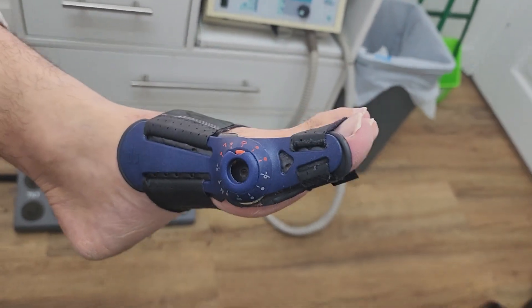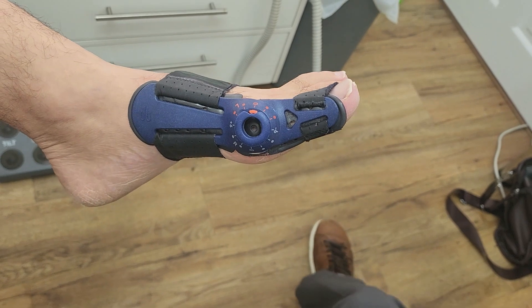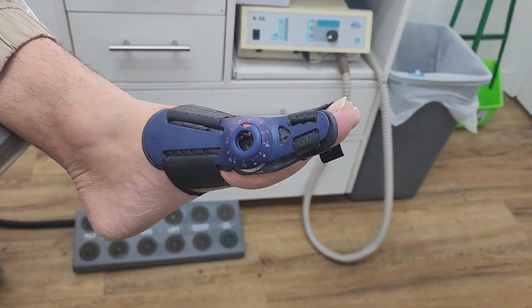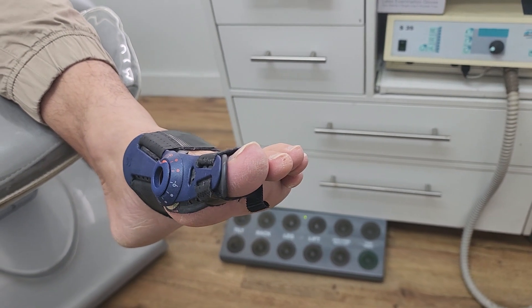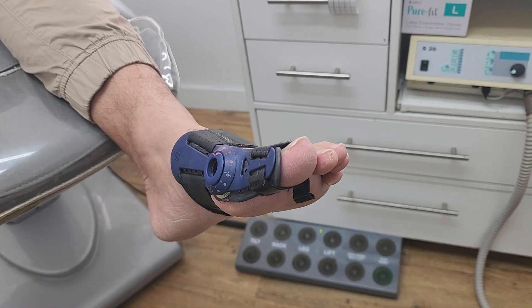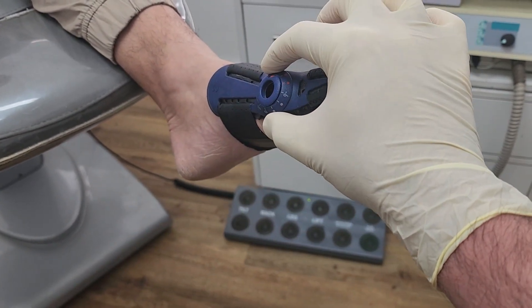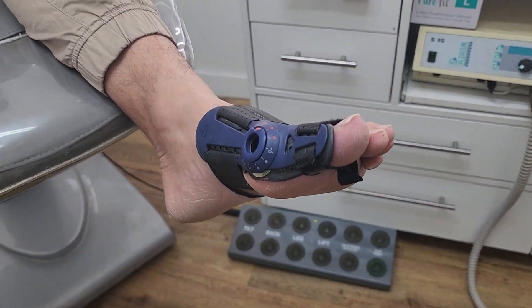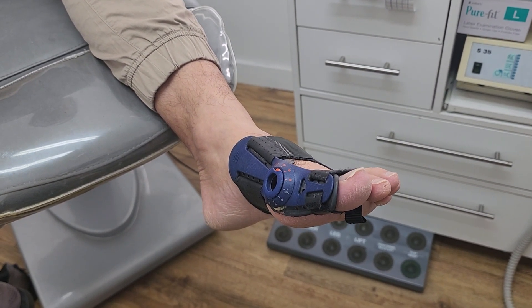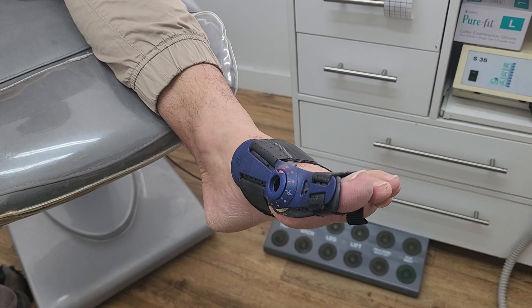What does it feel like when it's inside your shoe and you're walking? At first it was a bit difficult to adjust — the shoe becomes a bit more tight. But I think you slowly learn to adjust and know that it's there. Can you walk at a decent pace? Yeah, I can walk in it fairly normally. And does it cause you any discomfort where the straps are or adjacent to the bone? Not really. When I first put it in one of my shoes it was a bit of a tight squeeze and didn't really fit that shoe, so I tried another pair of shoes and it's pretty okay.